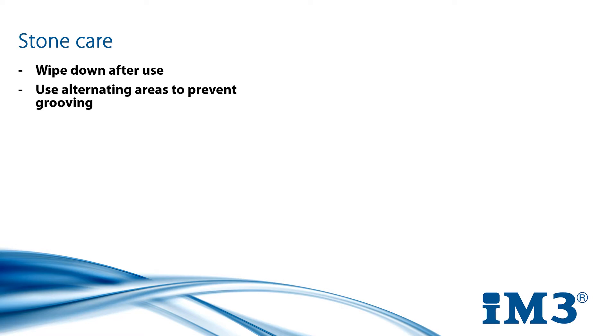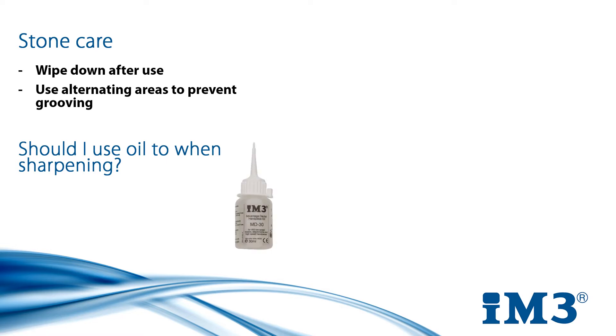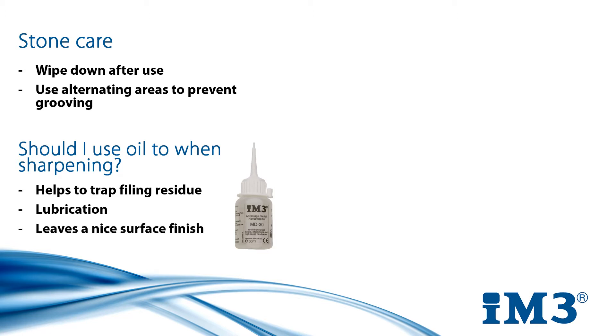A lot of people ask if they need to use oil while they sharpen. And while it is not completely necessary, it does have its benefits. Using oil helps to trap all the residue after you sharpen. It also lubricates the stone to avoid surface friction and leaves a nice surface finish on the blade.